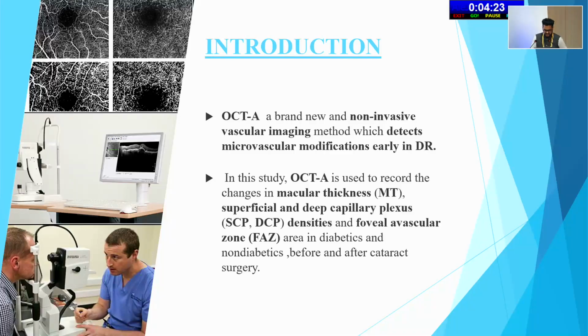Through OCTA, we have compared and drawn the data of macular thickness, the superficial and the deep capillary plexus, and foveal avascular zone before and after the cataract surgery.